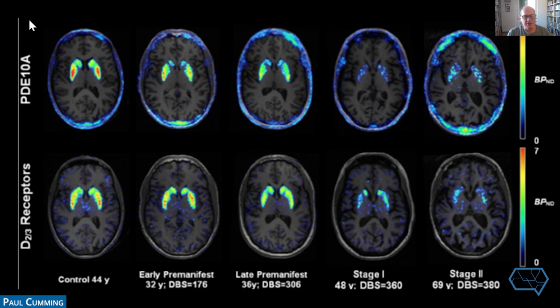But it shows that there's a very broad spectrum of different aspects of neurotransmission that are affected in Huntington's. And my main summary point is that there is a pre-morbid, pre-manifest pathology that can be detected by PET even before the neurological and psychiatric symptoms of Huntington's declare themselves.